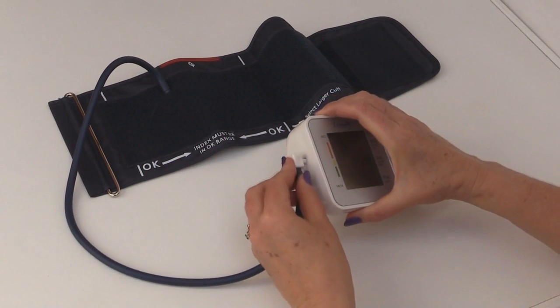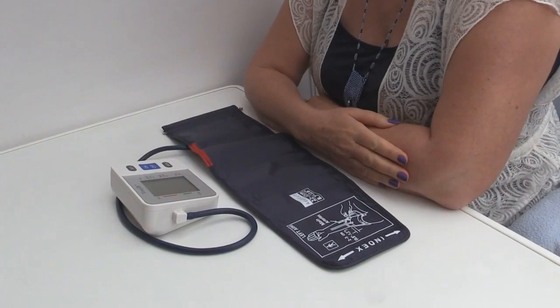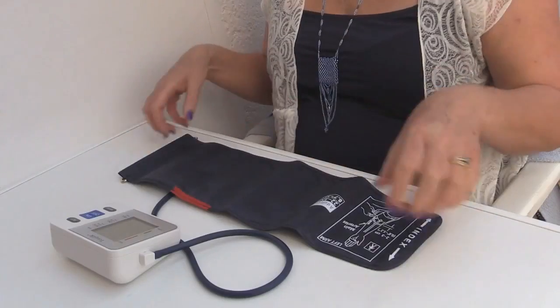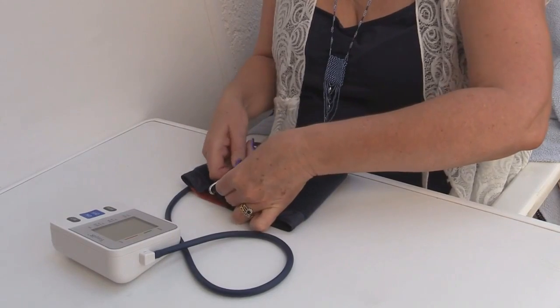Plug the pneumatic tube into the base unit. Sit comfortably at a table and rest your arms with your feet flat on the floor. To get the most accurate result, it is best to sit quietly for 5 to 10 minutes.